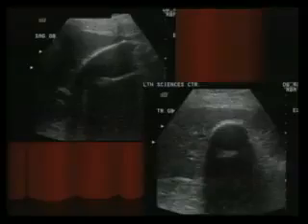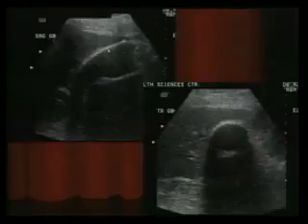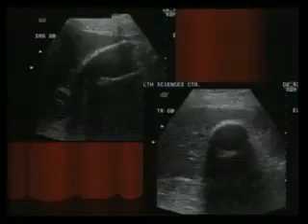Are there usually gallstones with this? Yeah, they usually have some gallstones. But that's a porcelain gallbladder. Here's what it would look like on ultrasound. It could be tough. You could say, well, there's a lot of shadowing, but we don't see the stones inside here. So it has to be coming from this. This is shadowing from this. You could say, well, could this be the wall echo shadow? But here we see the back of the wall. Wall echo shadow, you usually don't see the back.